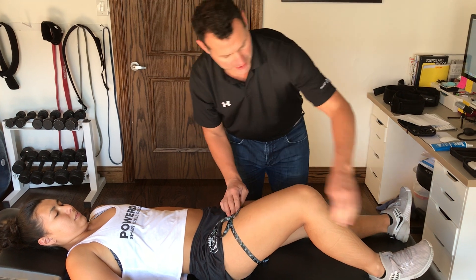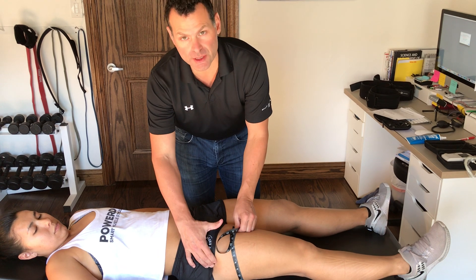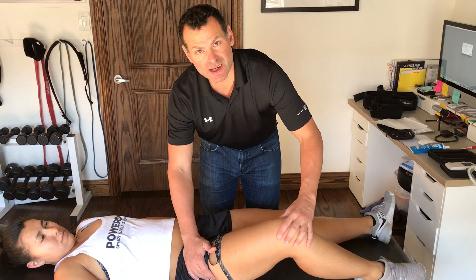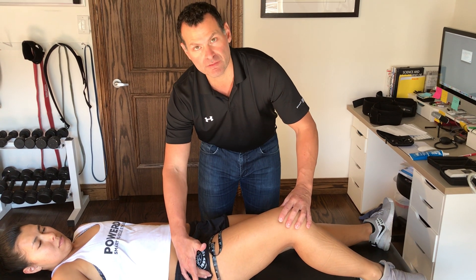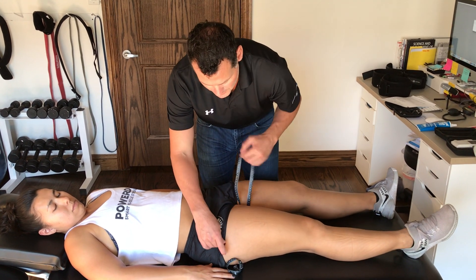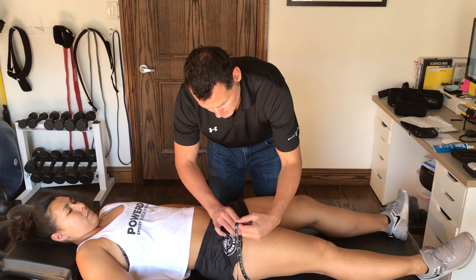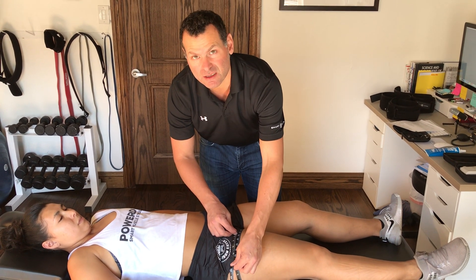If you're not sure where the greater trochanter is, come off the hip and feel for the bony prominence. Bring the knee up and then do internal and external rotation of the femur — you'll feel the greater trochanter right underneath your fingers. So I know I'm in the right place. I'm getting a measurement of about 27 inches.